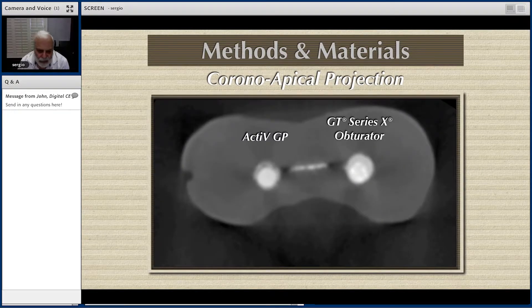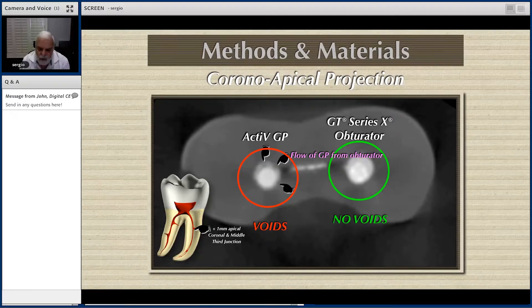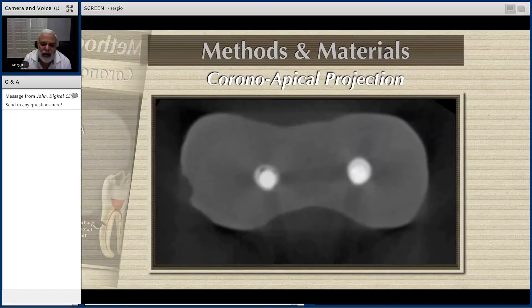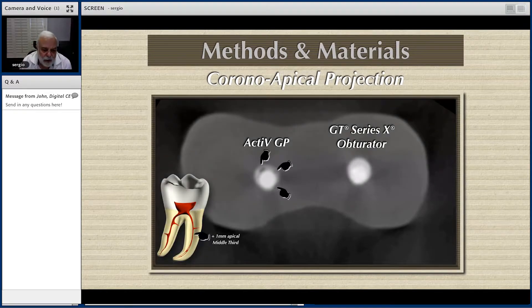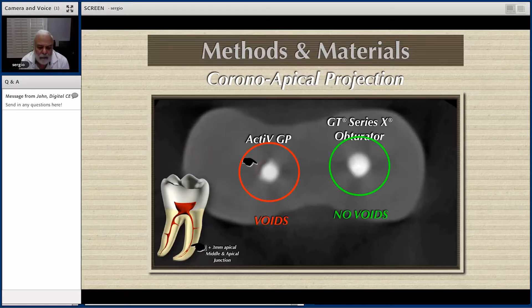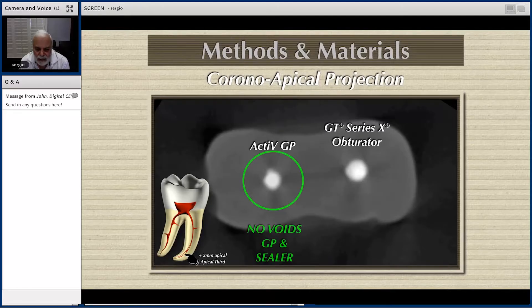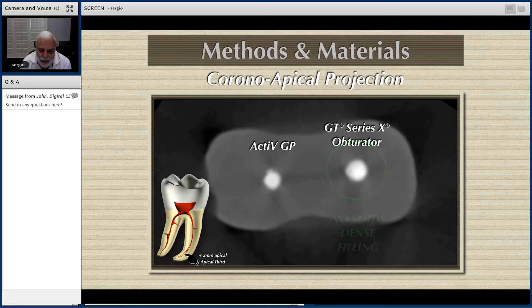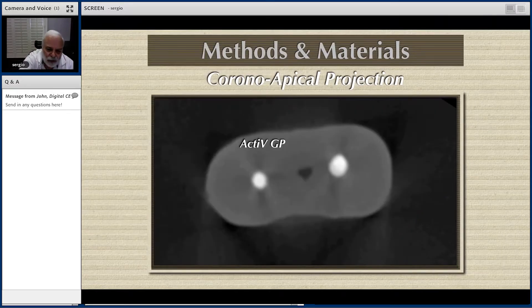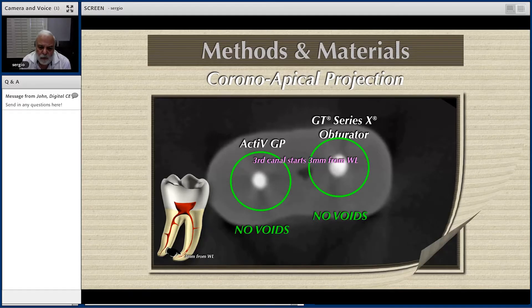Now we are going to what I think is the junction between middle and coronal. Look at the single cone — full of voids. No voids on the core obturator — no voids there. How the material is flowing from that canal, trying to fill that gap — it's because of the hydraulic forces of this type of obturation. They are full of voids all the way until you get to the working end. Look at this giant void — this is the junction between the apical and middle part of the canal. Then, once you get into the apical area with the single cone technique, we were not able to see voids, but that was only in the apical area, two millimeters from working end.